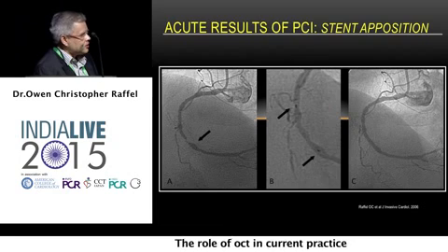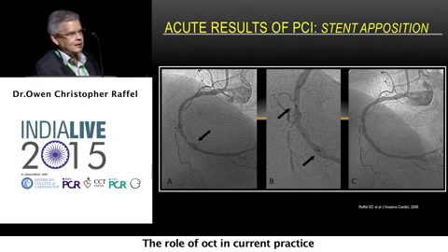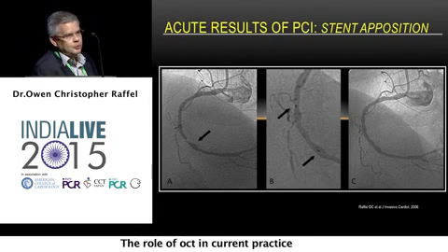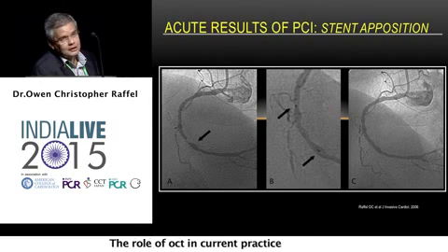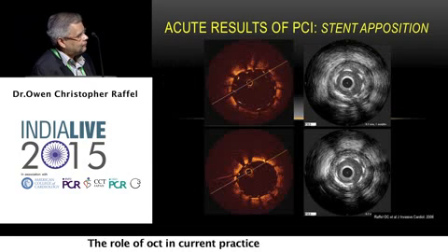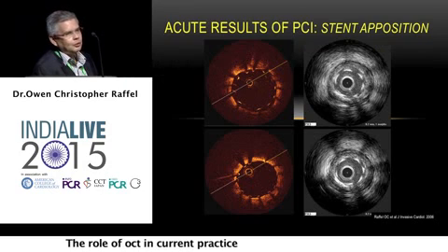Stent malapposition. This is a case of an RCA where we stented into a slightly ectatic segment. Because we wanted to stop antiplatelet therapy in 6 weeks for an operation, we just wanted to make sure everything was well apposed there, and geographically it looked okay. OCT clearly shows malapposition. You can't see it in IVUS here, but really here there's no ambiguity at all.